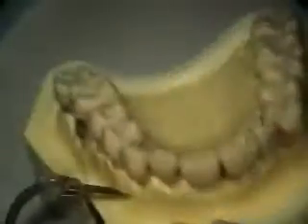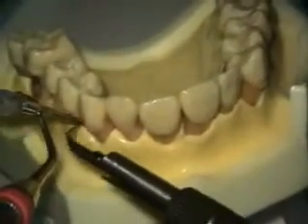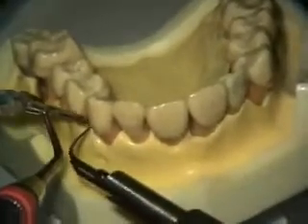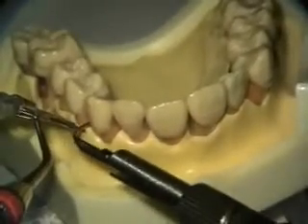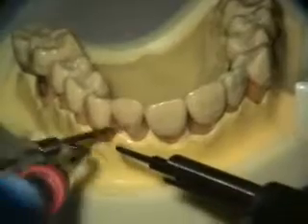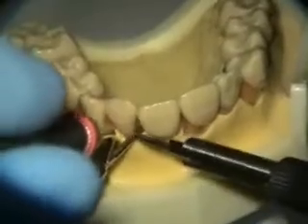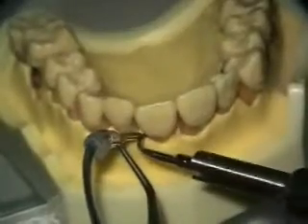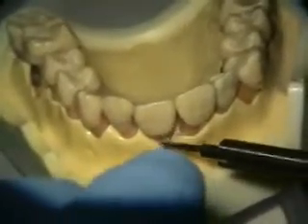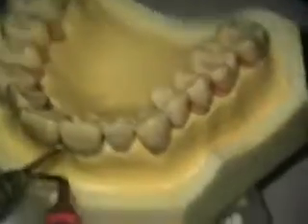Sorry, I'll have to just angle the microscope a little differently. Okay, cleaning here. You can look pretty far into the distal here, although I still use the angled one to look at that one. In the middle here, distal, toward the midline. You can get a lot of use out of just the right one on all the anteriors. You might have to move the patient over to the side when you get over here. A lot of times the water flows this way, so that's nice.